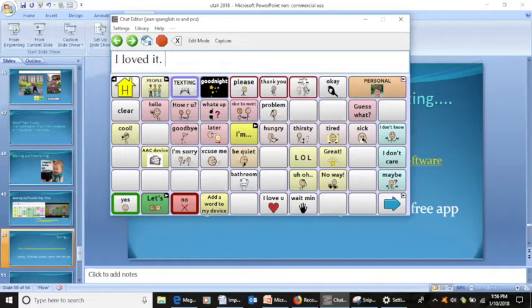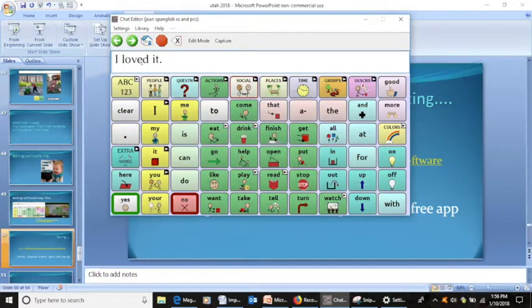and you download the free chat SMS software from Google Play. And that phone needs to be close to you. The device can be locked. It doesn't have to be online or anything. And then if you had it connected, you would see all of the contacts and everything in there, and they can go back to their program, and they can type a sentence, and then they can send it to somebody.